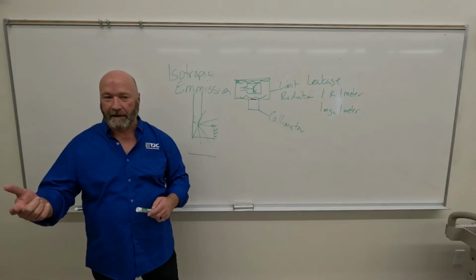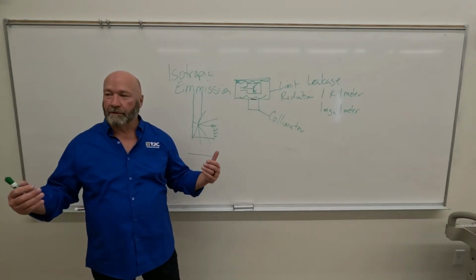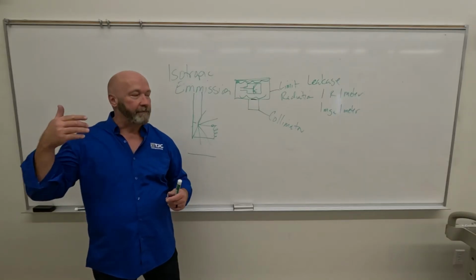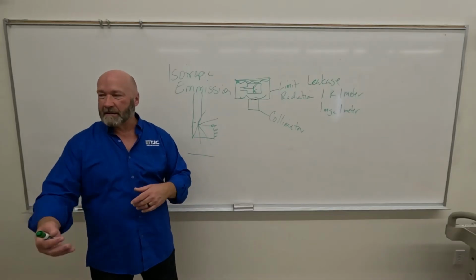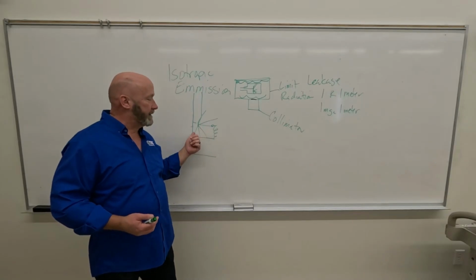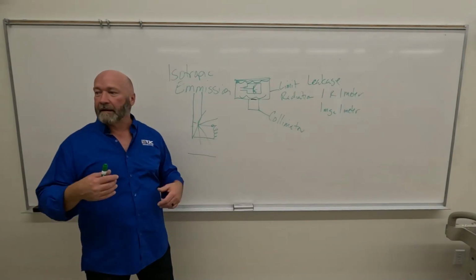With a vacuum tube, instead of a pressurized tube like what they used back in the early 20th century, we get more consistent exposure. They used to use partially pressurized tubes, so they had gas inside of it. And what happened with those is that we got erratic flow of electrons from cathode to anode, okay? So it wasn't consistent. The gas inside the tube interfered with the flow of electrons from cathode to anode. And if it interferes with the flow of electrons, then it will also interfere with the creation of X-rays. So we get erratic exposures.